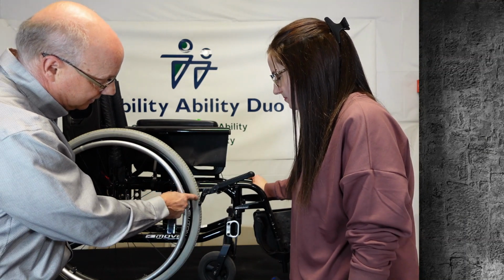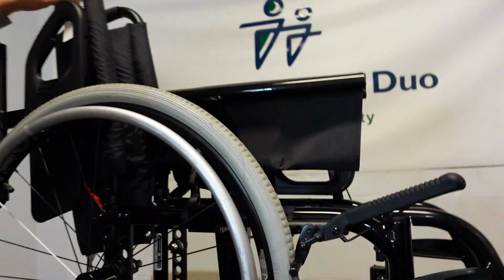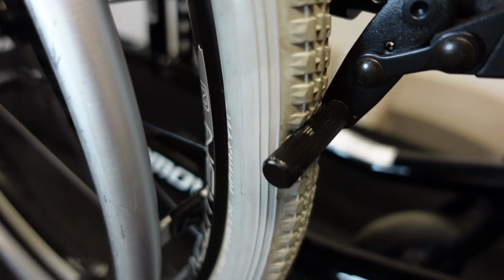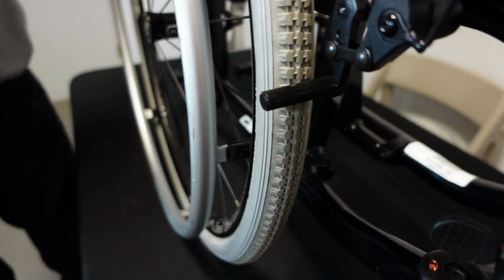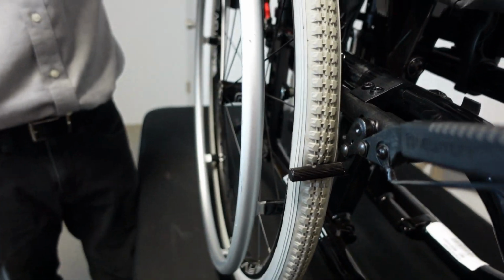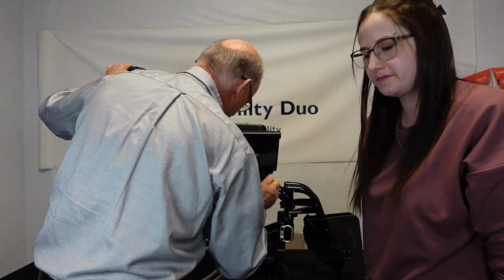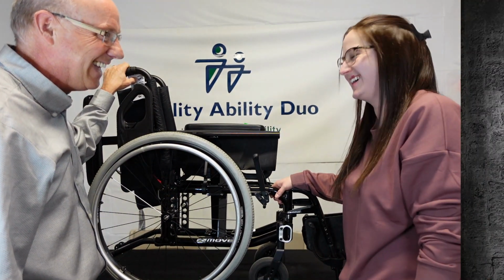Now this is biting, so when I try to turn it, it doesn't turn. Let's take a look. You can see that it's really biting. When we take it off, you just moved it back, and I like how it's straight. You've got the whole thing biting into it. It's not turned down and it's not turned up. It could be turned up a little bit more, but it's still pretty straight. That's pretty good. I'm glad you did that. It looks so easy.